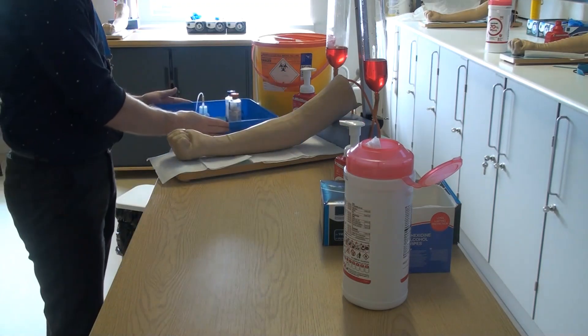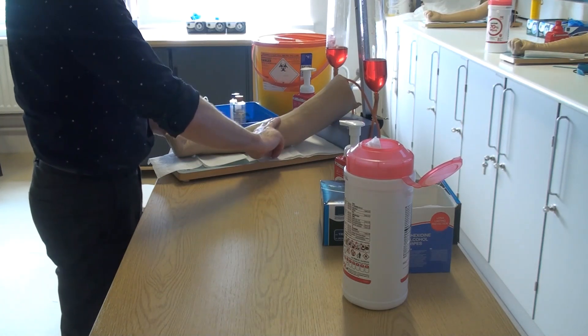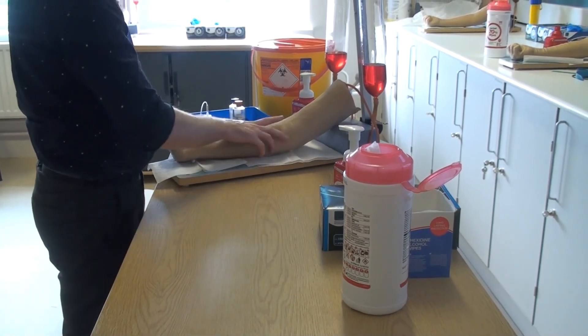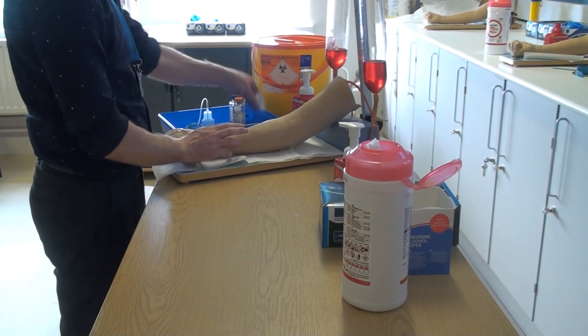Bring the items to the patient's bedside and begin by palpating an appropriate venous site for the sample. Common sites include but are not limited to the antecubital fossa or the dorsal aspect of the hand.